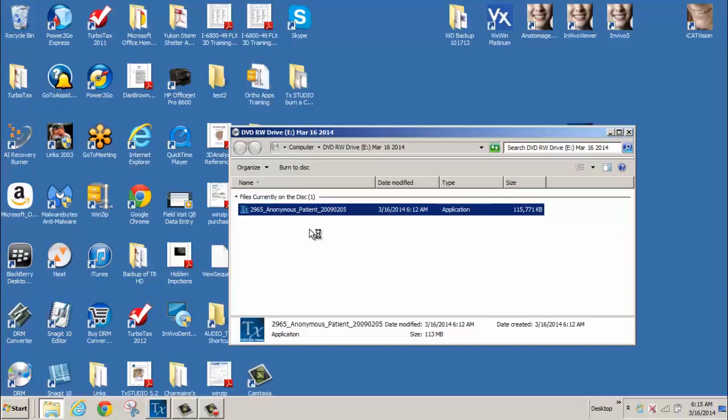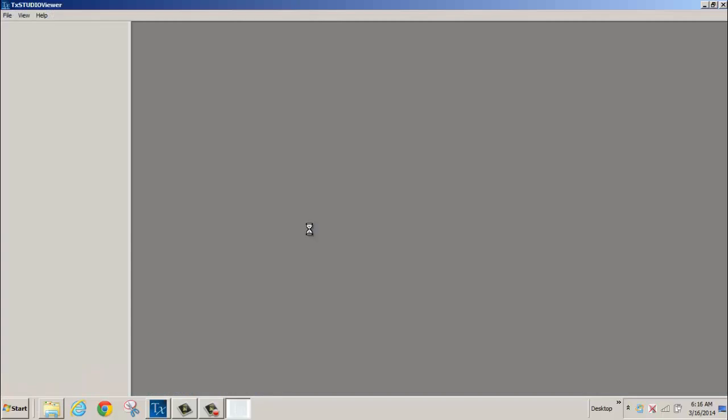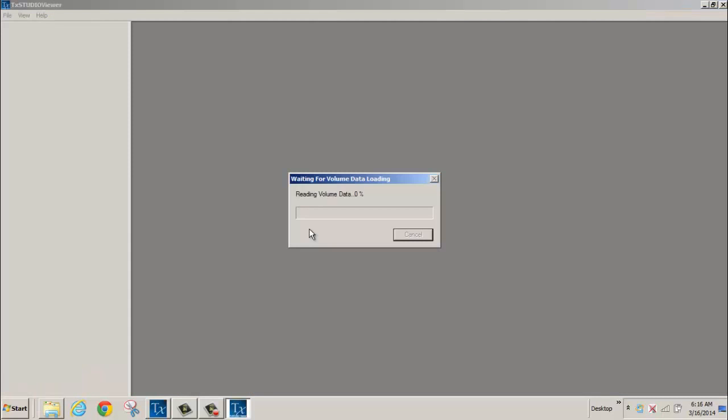If opening a case as Administrator, the User Account Control pop-up window will appear, asking do you want to allow the following program from an unknown publisher to make changes to this computer? Select Yes. Your computer is now preparing the scan to be opened in the included Treatment Studio Viewer software.